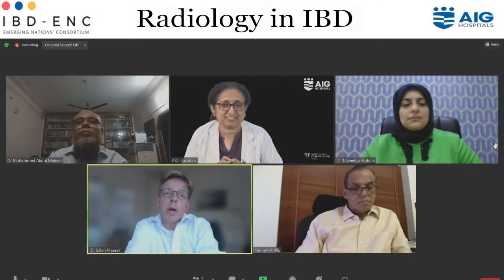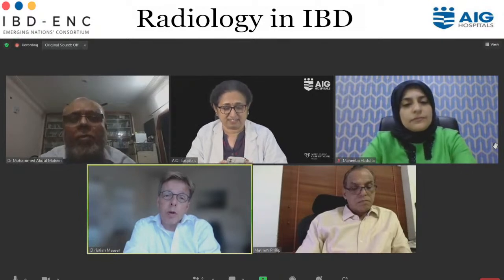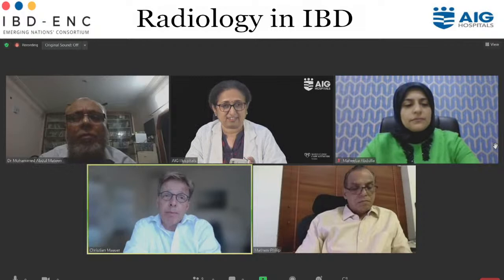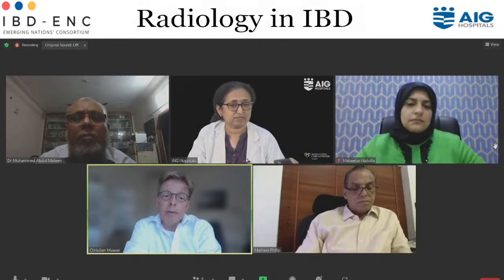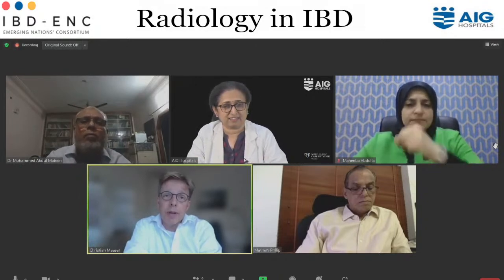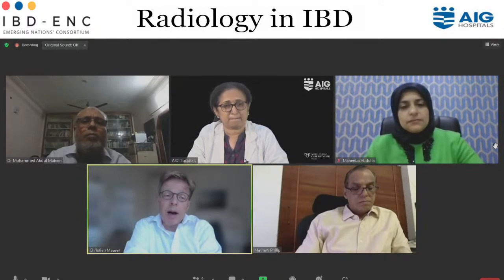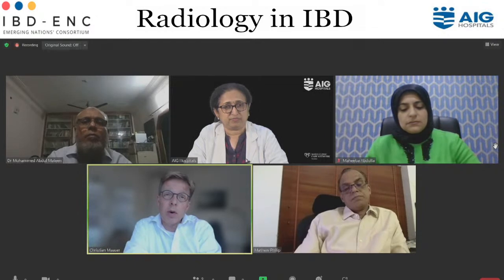A very good question. In our curriculum, with a 2.5-day hands-on workshop plus 4 weeks in the center doing it on a daily basis, the colleagues after those 4 weeks are ready to start back home and find inflamed versus non-inflamed bowel. Complications are not as frequent as inflamed bowel, so it takes a bit longer for that, but after 4 weeks of hands-on training, you are for sure able to pick up the inflamed bowel versus non-inflamed. That's the training and learning curve, and we would say that you need 200 to 300 examinations to become more comfortable.